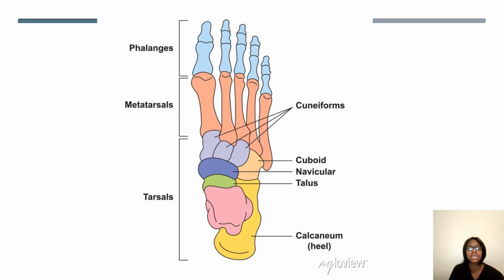And then this is just your anatomy. Just make sure that you know this information because you also need to know how to pick it out on your test. You need to know what you are covering whenever you are doing the scan.